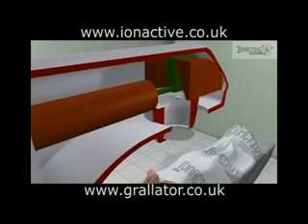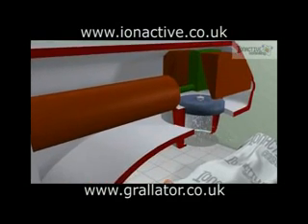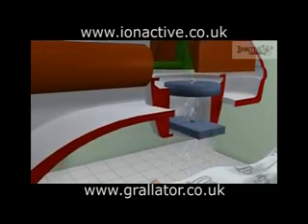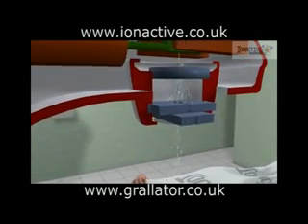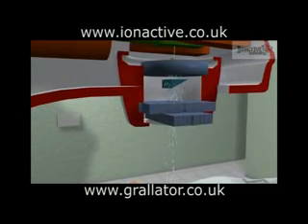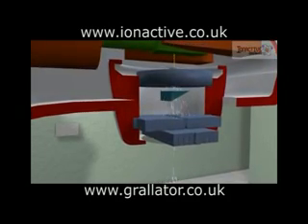The most common modification is to convert the electrons to X-rays by colliding the beam with a suitable target. The X-rays produced are collimated by the primary collimator, which absorbs all but the X-rays travelling in the required direction. The beam is then subject to further modification by using secondary collimators to refine the shape of the beam as required. Additionally, wedge and shaped filters may be introduced to produce a gradient across the X-ray field. Such modifications can produce, for example, a uniform dose along a defined plane of the target object or patient.